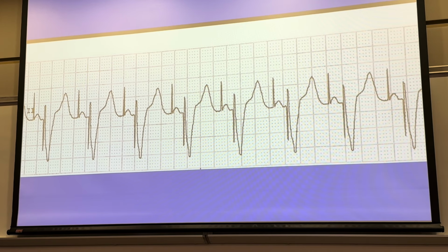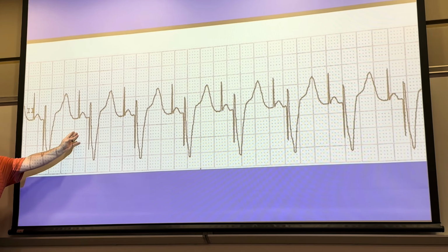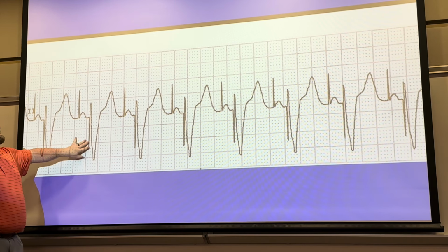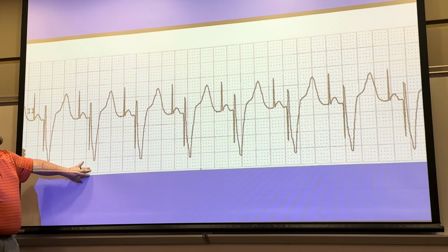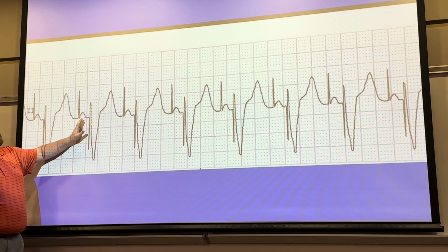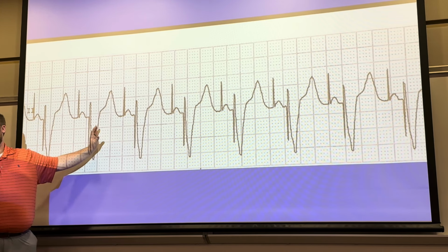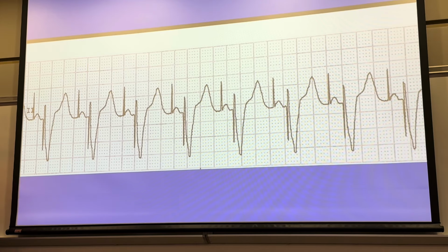That's where I get that A pace from. I have to send electrical current through my heart for that atrium to beat. So that pacer spike is making that atrium beat. Remember, our QRS complex is our ventricles contracting, ventricle depolarization. I have my pacer spike right before my QRS complex. I have to send that electrical current through the heart to make that ventricle beat. All right? So AV pacing.